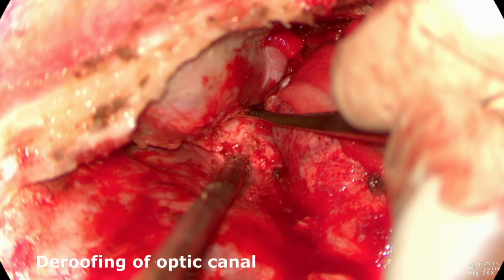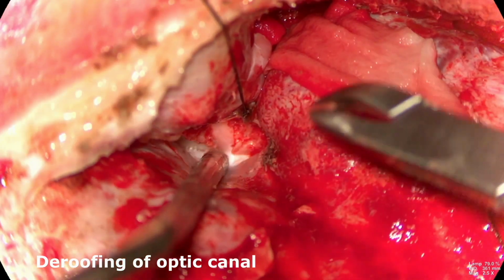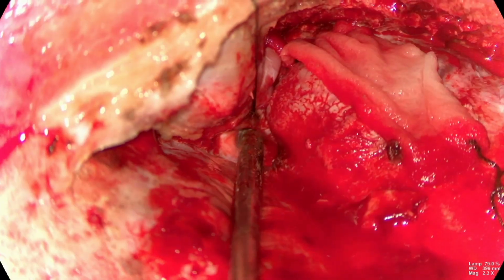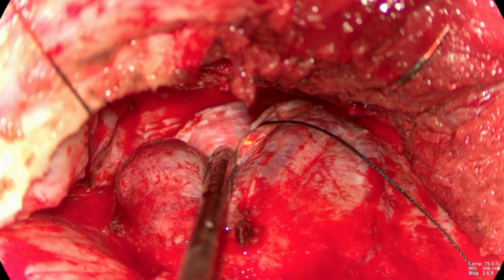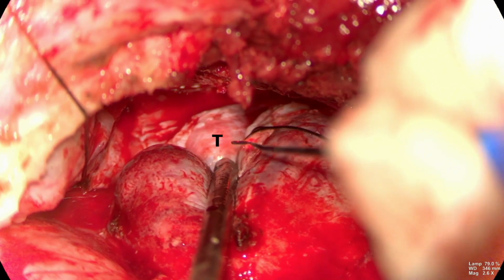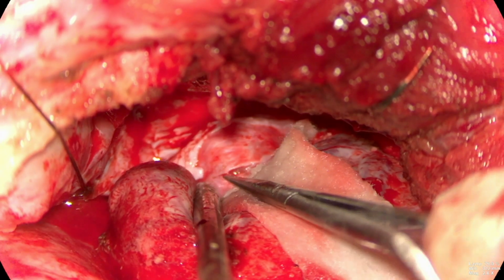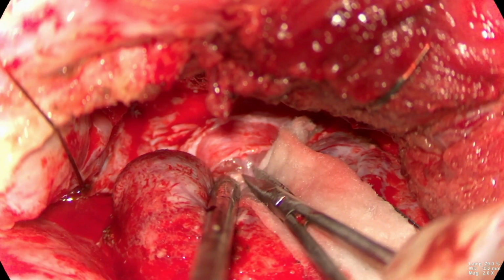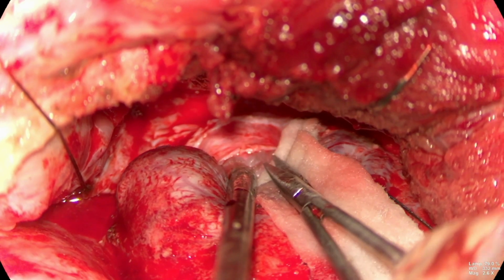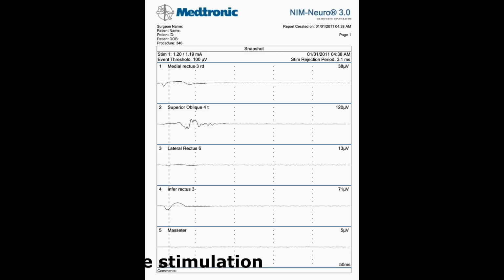Anterior root of the anterior clinoid process was removed by deroofing the optic canal. You can see the tumor projecting through the lateral wall of the cavernous sinus. The fifth nerve branches are draping over it. So a cut was given in the direction of the V2 division. Fourth nerve was stimulated and compound muscle action potential was confirmed.